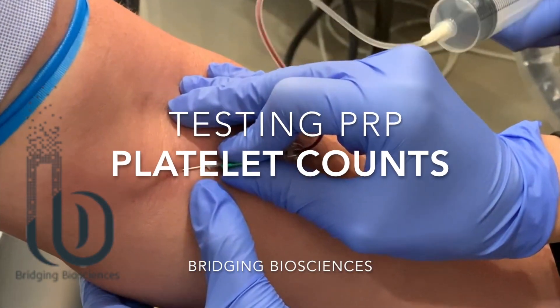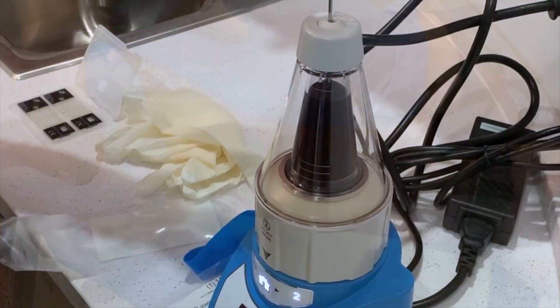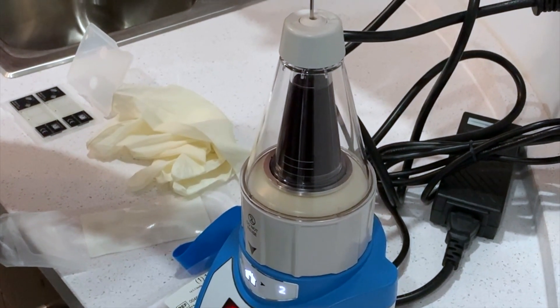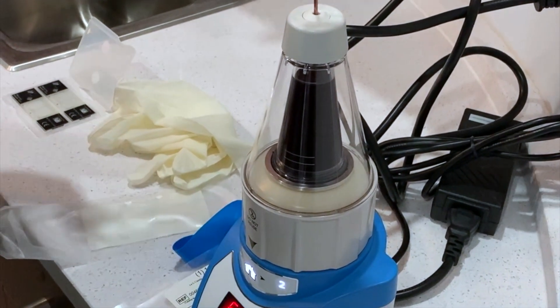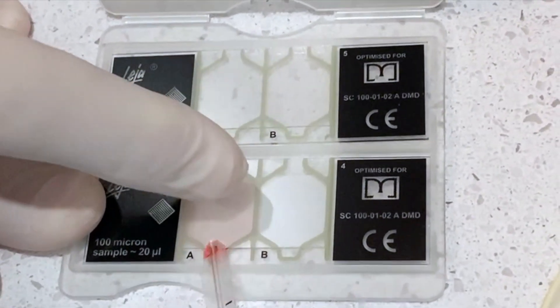Bridging Technologies has a new way to identify the platelets in PRP and count them. It is as accurate as flow cytometry. What we are doing today is testing the platelet count in our Genius system.